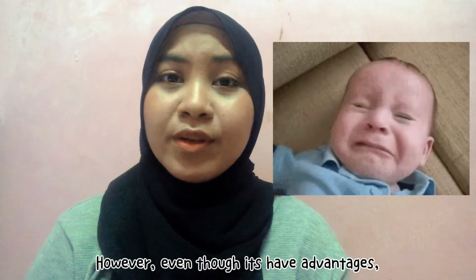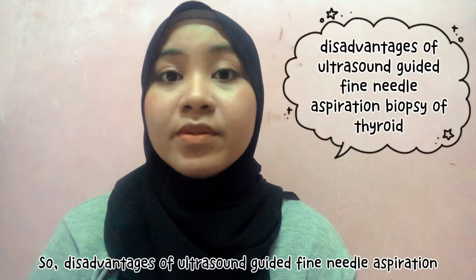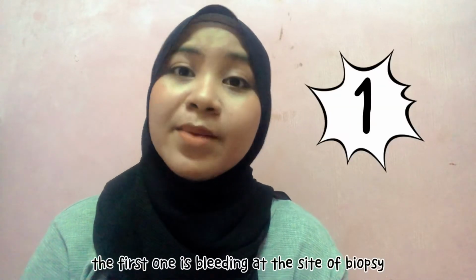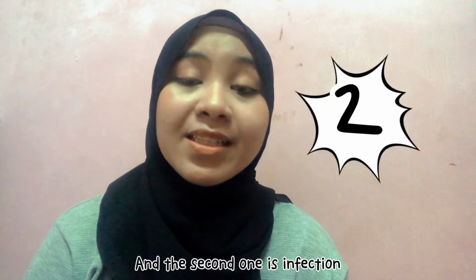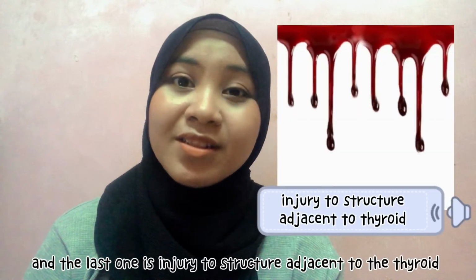However, even though it has advantages, it also has disadvantages. So, the disadvantages of ultrasound-guided fine needle aspiration biopsy of the thyroid are, the first one, bleeding at the site of the biopsy. And the second one is infection. And the last one is injury to the structures adjacent to the thyroid.